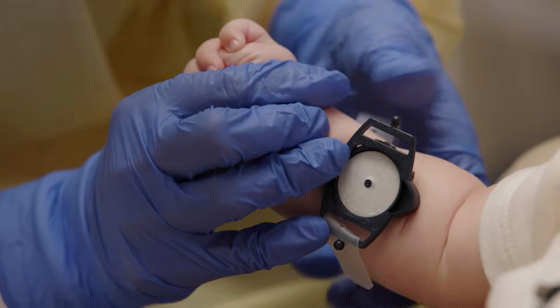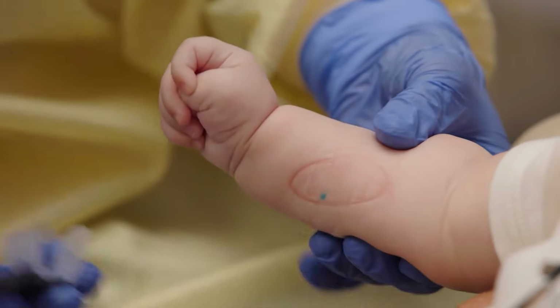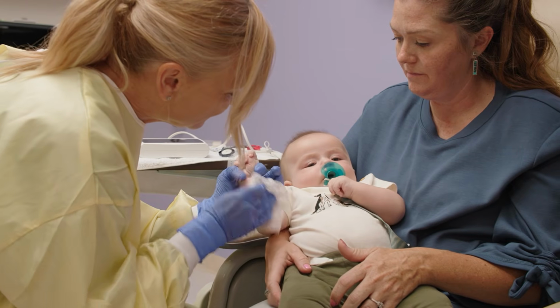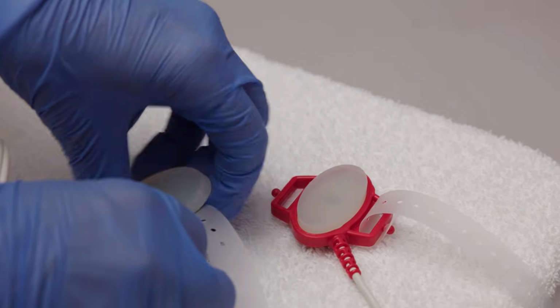Collecting 2 specimens from different sites is recommended to provide quality assurance and reduce the chance of obtaining an insufficient specimen. Specimens from 2 sites cannot be pooled for analysis. Detach the collector from the collection site. Rinse with CLRW and dry. Remove and discard the gel discs.